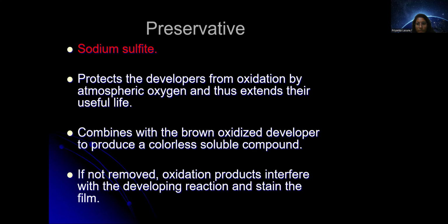Preservative: sodium sulfite. It protects the developer from oxidation by atmospheric oxygen. This extends their useful life. It combines with the brown oxidized developer to produce a colorless soluble compound. If not removed, the oxidized product interferes with the developing solution and stains the film.